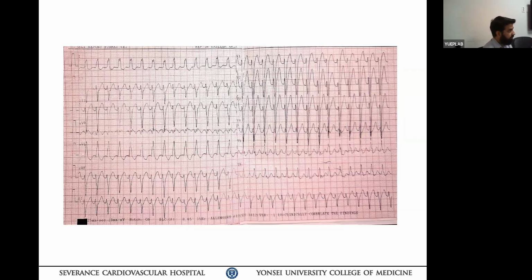But if there is a conduction block or a very fast atrial arrhythmia without one-to-one conduction, it can be AV dissociation even under SVT. Okay.